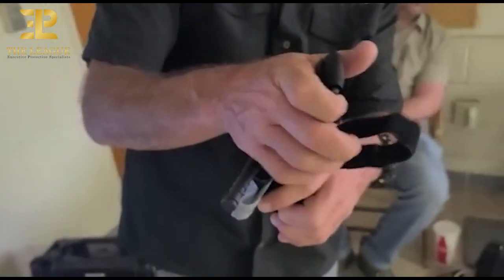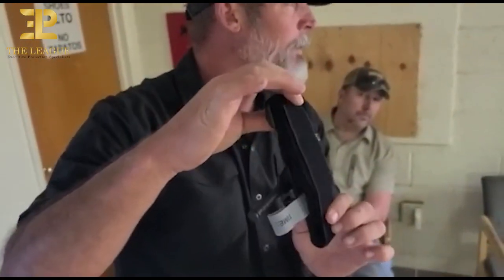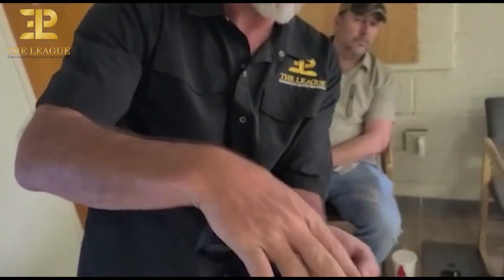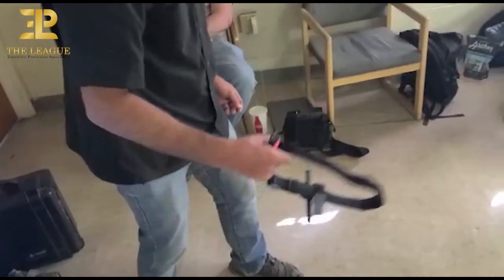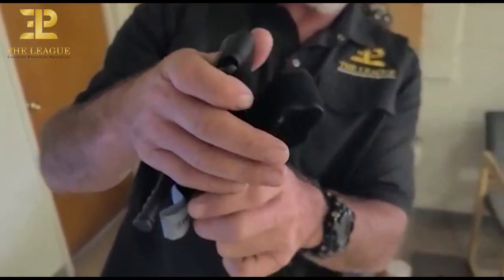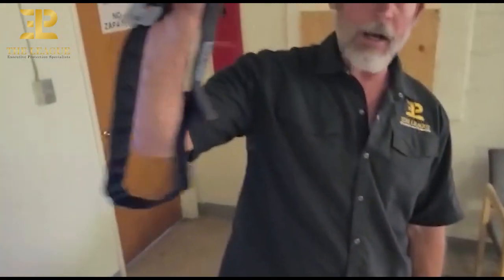Marry up the Velcro against the nylon — not Velcro on Velcro, because then when you deploy it, you've got to fight to get that out. No good. You want Velcro on the nylon, so when you deploy it, it comes right out.